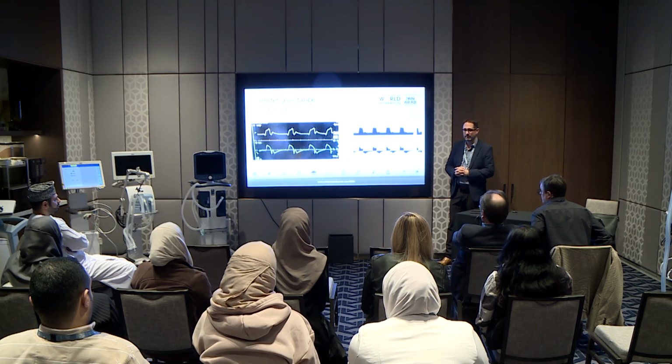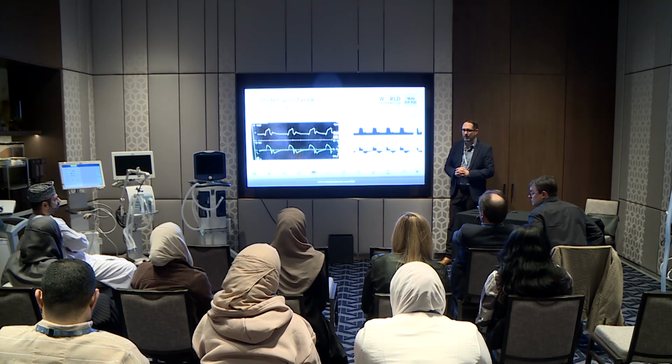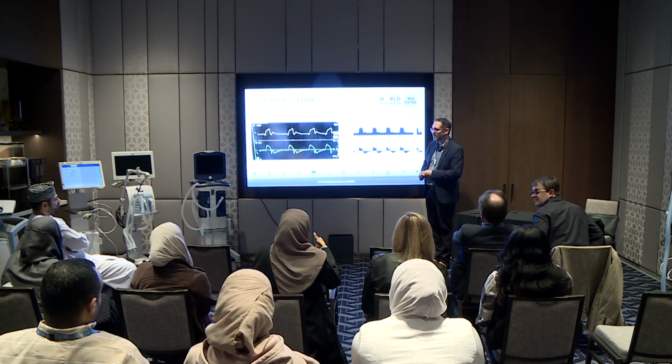Yes, why do you think that? Look for evidence of trigger. Because there's no trigger. There's no drop in pressure, and the patient is trying to make an effort in the middle of the breath.